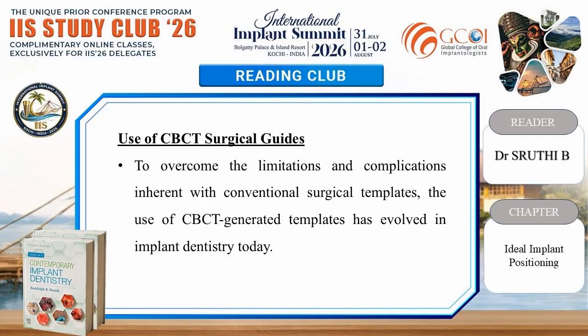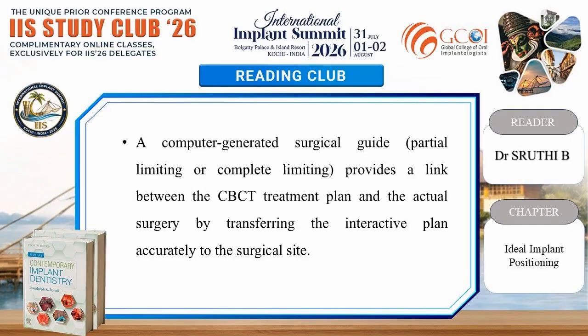Use of CBCT surgical guides. To overcome the limitations and complications inherent with conventional surgical templates, the use of CBCT generated templates has evolved in implant dentistry today. A computer generated surgical guide, partial limiting or complete limiting, provides a link between the CBCT treatment plan and the actual surgery by transferring the interactive plan accurately to the surgical site.